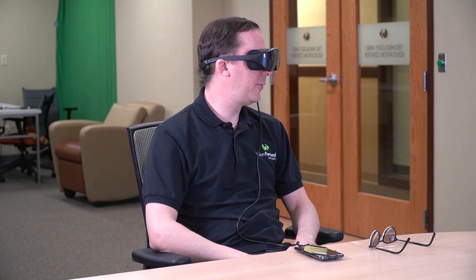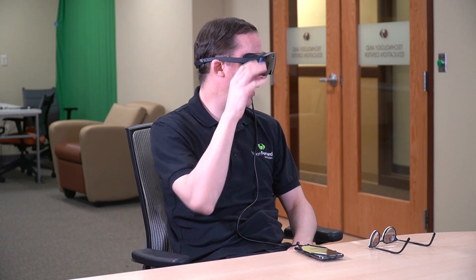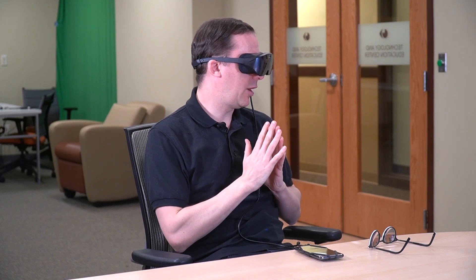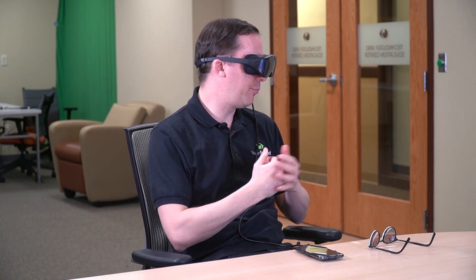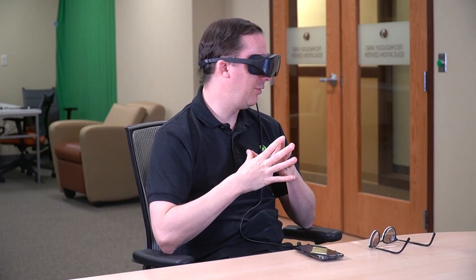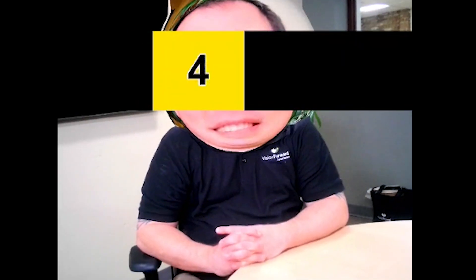One of the other features is the bubble mode. This is actually when Iris Vision first came out with their Live device — it was one of their unique features, and here it is now in the Inspire. Basically we have a circular area called the bubble somewhere in your field of view, and inside that bubble things are magnified. It's kind of like the bioptic mode, but that was rectangular and this is circular. We can change the position of the bubble, change the size, and zoom in and out within it. Currently as I'm talking to you, I have your face inside the bubble and your face is magnified — so it looks like you have an even larger head than normal. Let me out of this bubble — I can't breathe! Quiet on set.